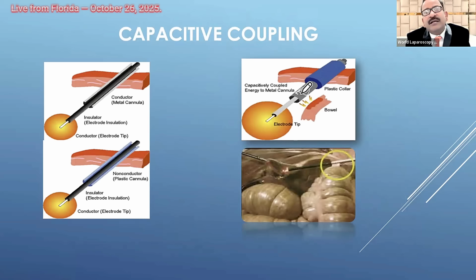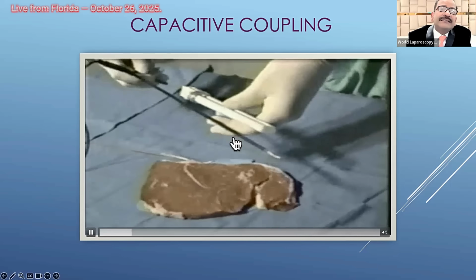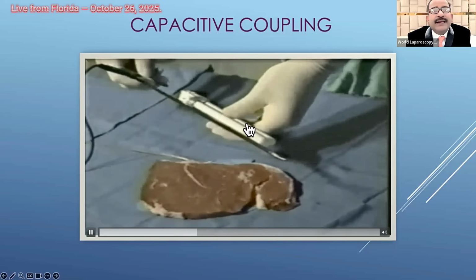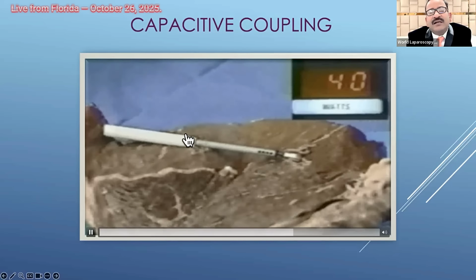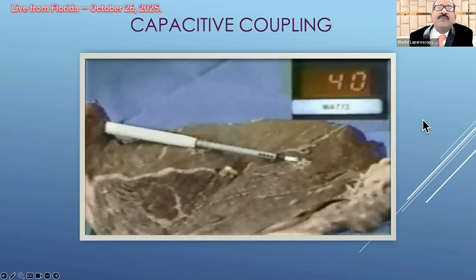inside reducer will become like a capacitor, and it will attract the electrostatic current, because a lot of electrostatic current is generated. We can see this tube light is not attached with any wire, but it is lighting, because a lot of electrostatic current is generated, and we can see it is burning. So inside metal and outside plastic is also dangerous. That is called capacitive coupling.